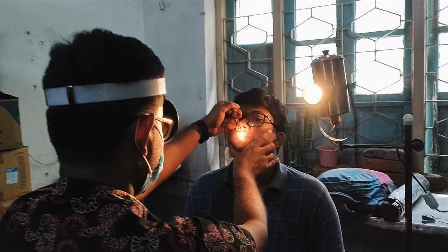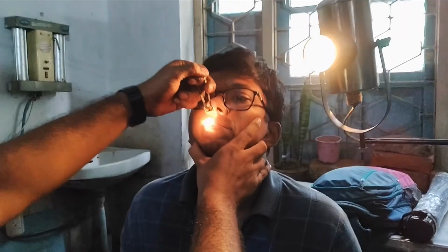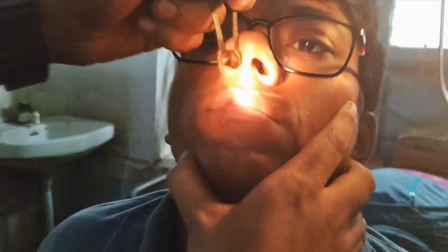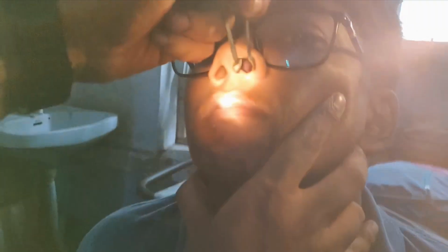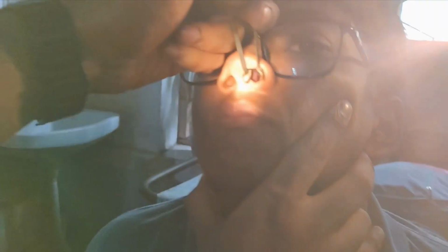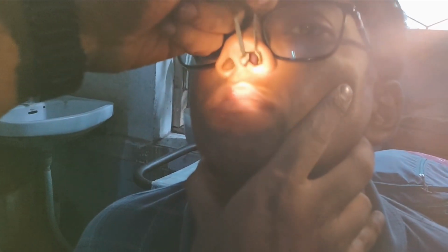After focusing the light, that is how you dilate the external nares so that you can have a good look inside. You need to know the structures that you can normally see in anterior rhinoscopy. Normally you can obviously see the vestibule and the anterior part of the nasal septum, and the inferior turbinate is always visible. If you are lucky, you may be able to see the middle turbinate as well. So that is anterior rhinoscopy.